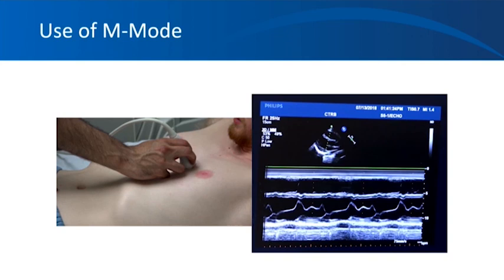An EPSS of more than 7 millimeters may be associated with left ventricular systolic dysfunction, because the reduced stroke volume results in a decrease in the amount of blood moving through the mitral valve in early diastole.